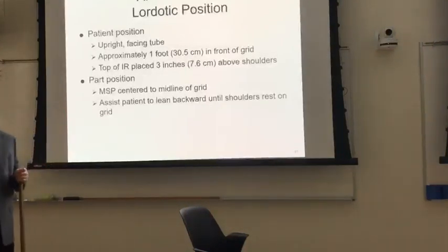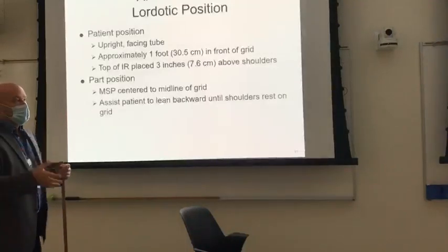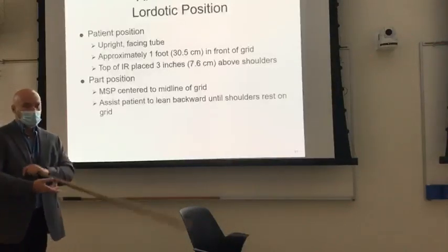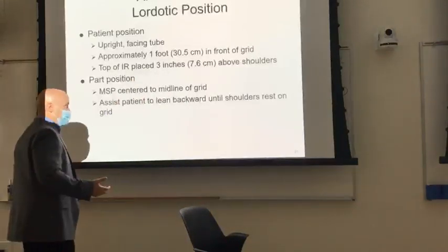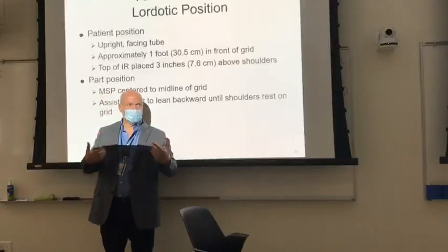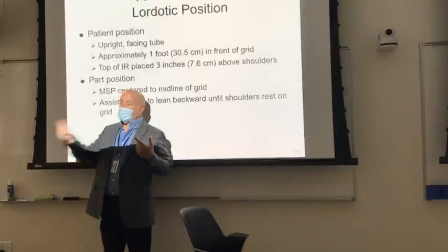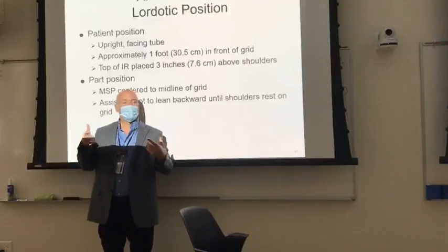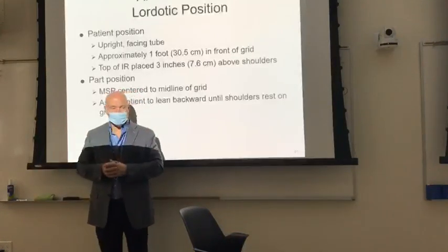I'll tell you what the book says, and then I'm going to tell you what you really should be doing. Most of the time, these patients are really, really sick. This says AP, apical lordotic. So AP would be AP projection, right? AP is always projection, AP projection. But it's AP axial, and axial means angle on the central ray. Okay, either angle on the anatomy, or angle on the central ray.